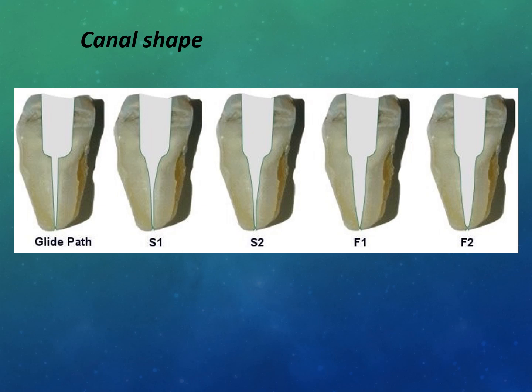The first one is glide path usage. These are the sequential steps of how your canal is increased with the ProTaper system. The first one is a glide path, that is your size 10 file or size 15 file or separate glide path pathfinder files. The next is your S1. When you say S1, only the coronal portion is increased. So that is S1.